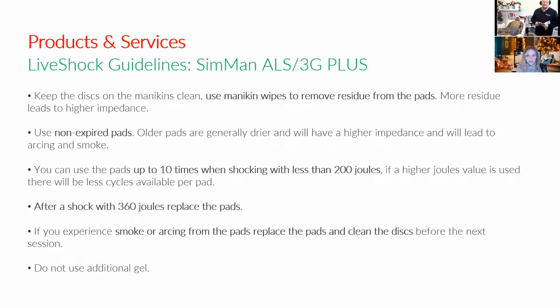We can certainly send this maybe as a follow-up or on our resource page on the Laerdal landing page that we have for our webcast. If you haven't seen that yet on the resource library, you'll get a link to it after this episode. And then the last two being, if you do experience smoke or arcing, again, Shane mentioned, replace the pads, clean the discs before the next session. And another important one is do not use additional gel. So Shane, what do we have to say about that one?